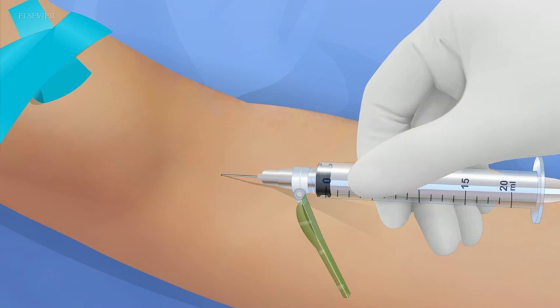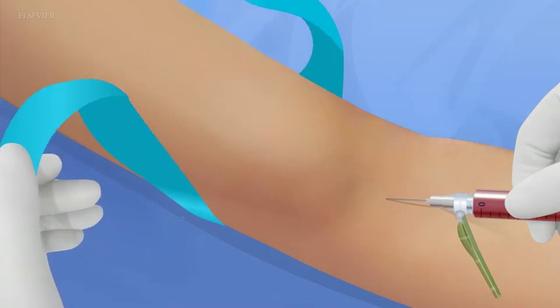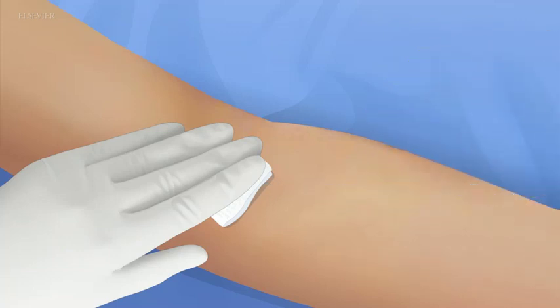Needle and syringe method. Gently aspirate 20 milliliters of blood into an appropriate size syringe. If the blood is flowing sufficiently, and if a tourniquet was used, release the tourniquet just before filling the syringe. Apply a sterile 2 by 2 inch gauze pad over the venipuncture site, but do not apply pressure. Quickly but carefully withdraw the needle from the vein. Immediately apply pressure over the venipuncture site with gauze until bleeding stops.